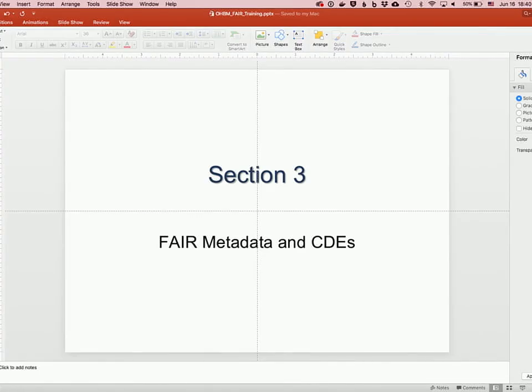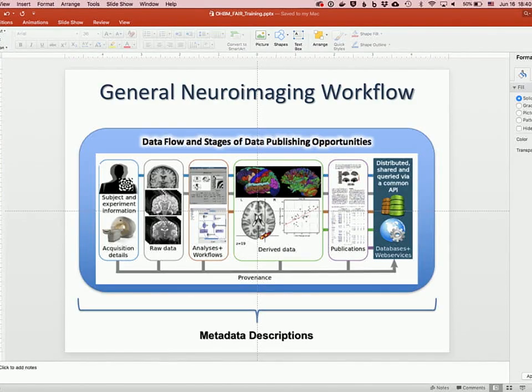Okay, so I know that some people are still working and are being helped. I'm going to start on the next section a little bit, but we're going to come back to the bids exercise in 2 slides so we can keep on working on the bids. But in the next section, we're going to talk a little bit more about metadata.